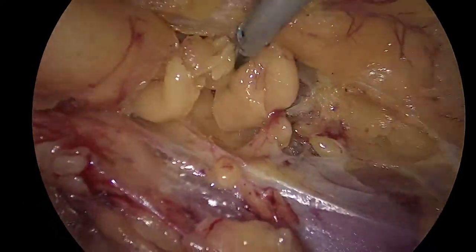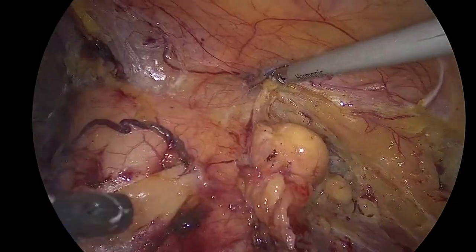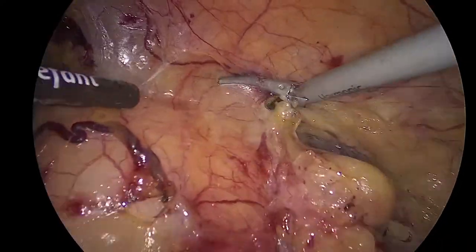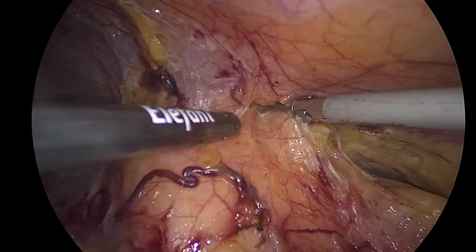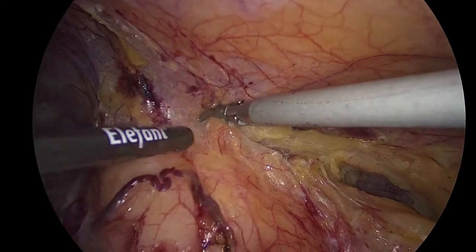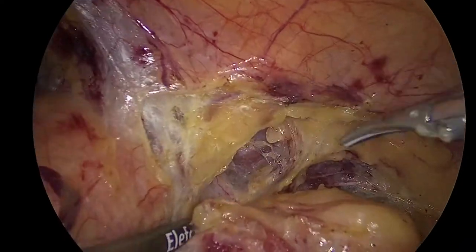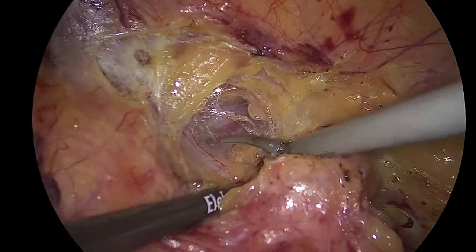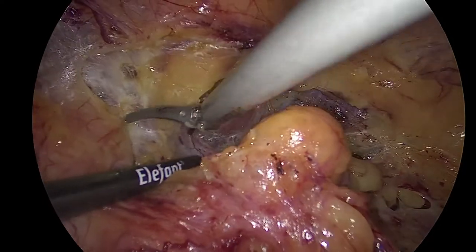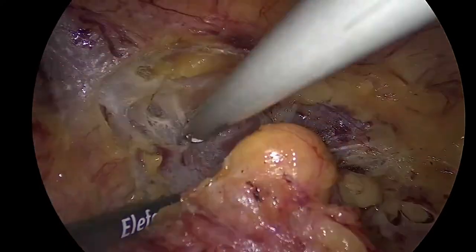Don't come closer. Show me up. A lot of people do not like to dissect at all on the sides here. I like it. You just leave a part of the kidney hanging towards you. You will see why I like it, because you can mobilize. First of all, on a partial, you will need it for sure. But even in radicals, I do this step, this move, because it really gives me the possibility to mobilize the kidney and pull the kidney up all the way with my assistant support. You will see that.